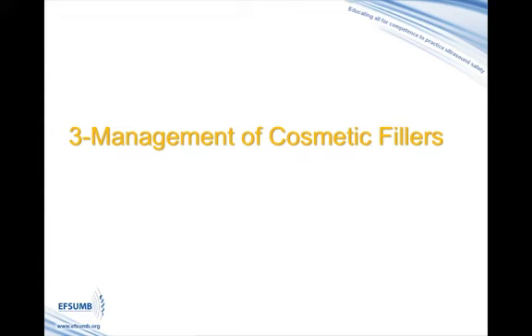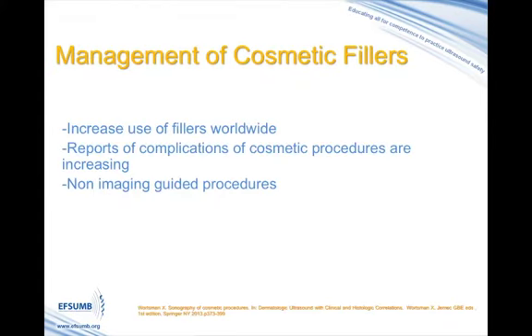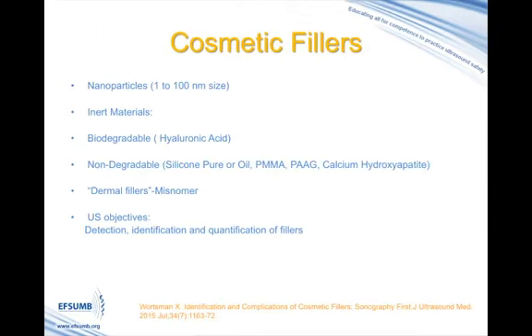We know that the injection of cosmetic fillers is increasing worldwide. At the same time, the reports of complications of cosmetic procedures are increasing. And as you know, most of these procedures are non-imaging guided. But what are cosmetic fillers?